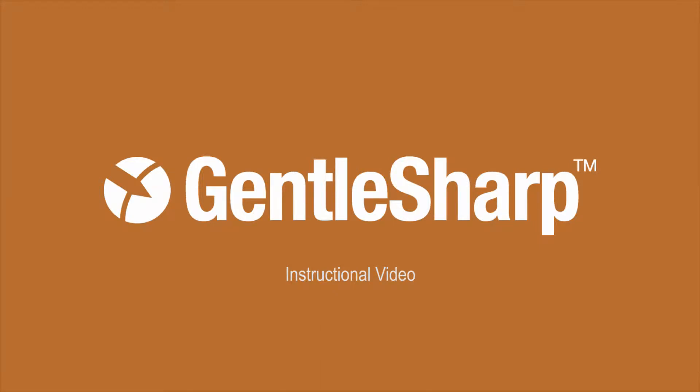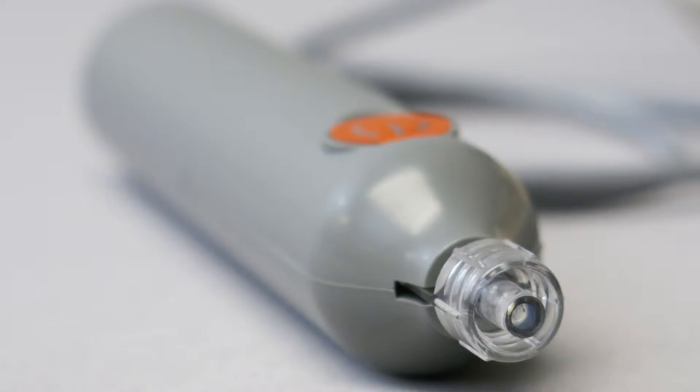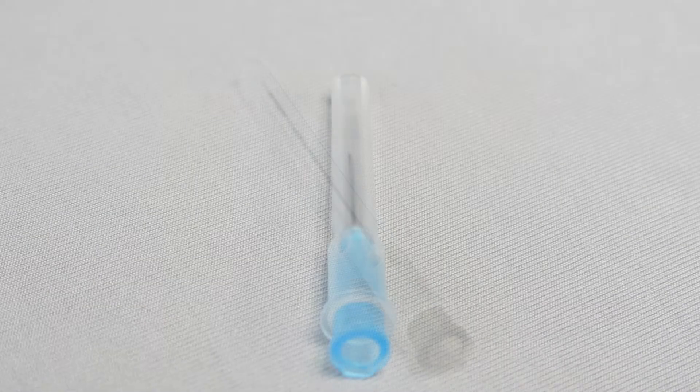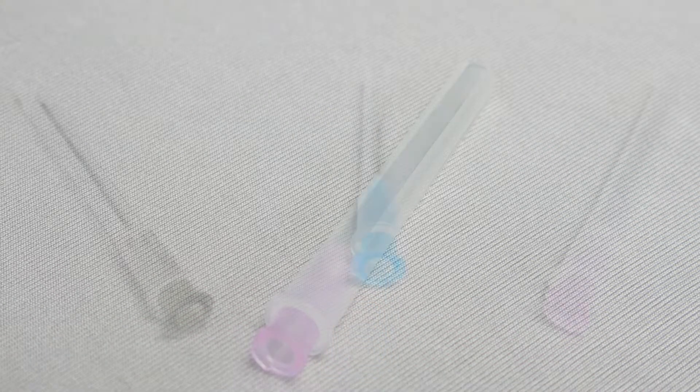Hello and welcome to the GentleSharp training video. GentleSharp is used to perform vascular punctures for the purpose of obtaining blood samples in rodents. The device consists of a handpiece connected to a control box and is compatible with standard Luer lock and Luer slip needles or lancets, referred to as sharps in the video, which are sold separately.